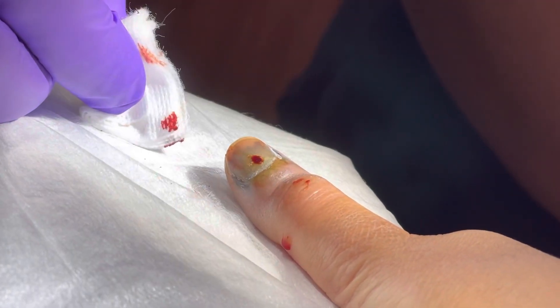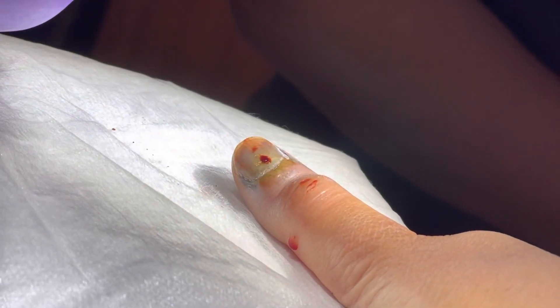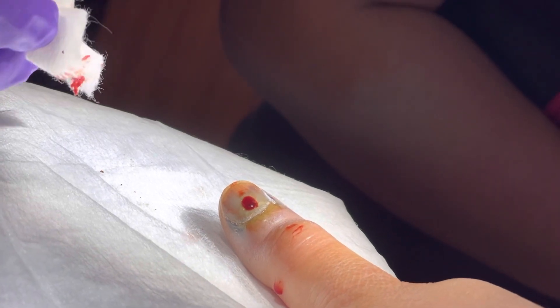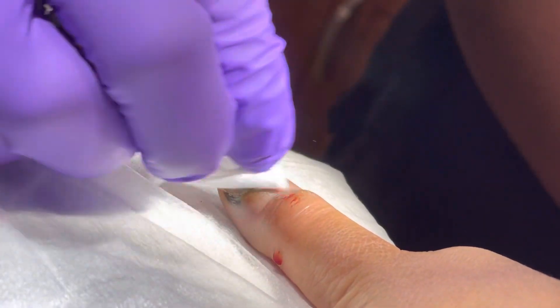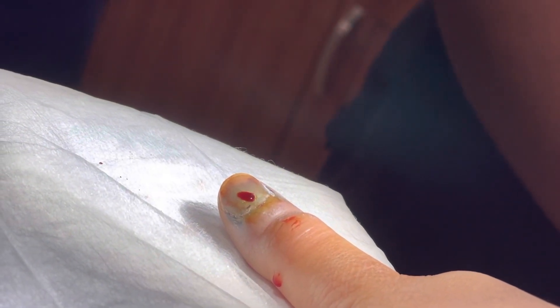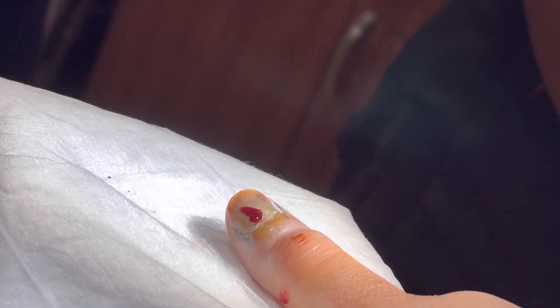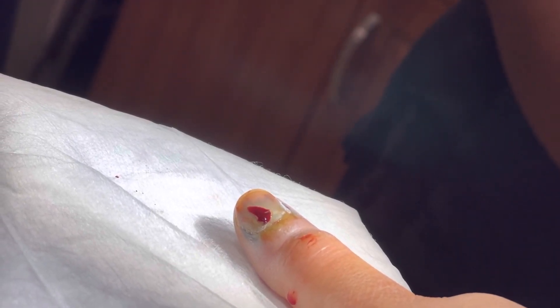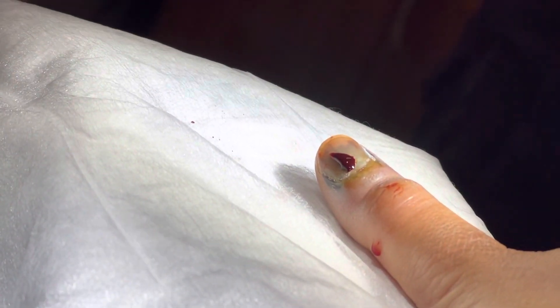This is awesome. Is it painful though? No, not with the digital block. Will I feel the pain after? In a couple of hours — no, you're not going to feel pain because it's just the nail. But the reason I had to numb it up was in order to even touch it, because when you feel that heat, that would hurt. And also putting pressure on it hurts.